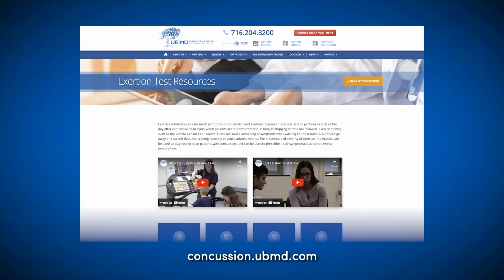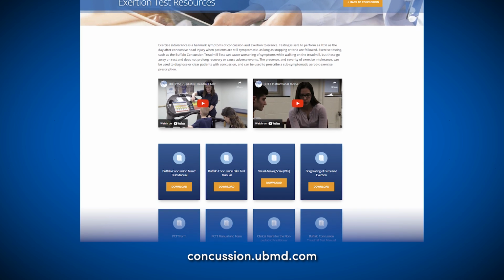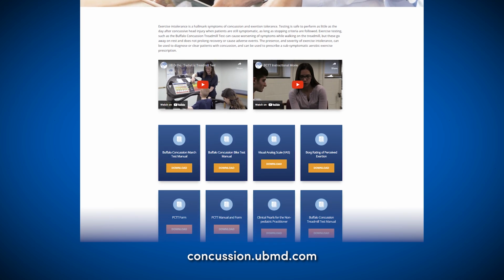Here at the University at Buffalo, we are proud to have developed the Buffalo Concussion Bike Test, or BCBT. This video is designed to help teach you how to administer and interpret the BCBT. Additional resources on the BCBT and other concussion assessment tools can be found on our website, concussion.ubmd.com. Before we start, here is a word from our research team.